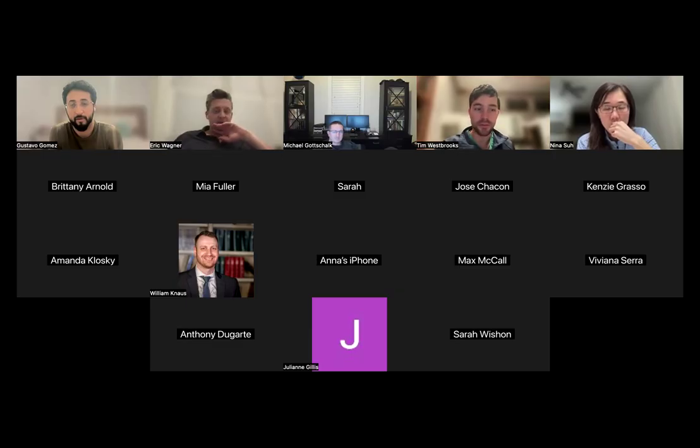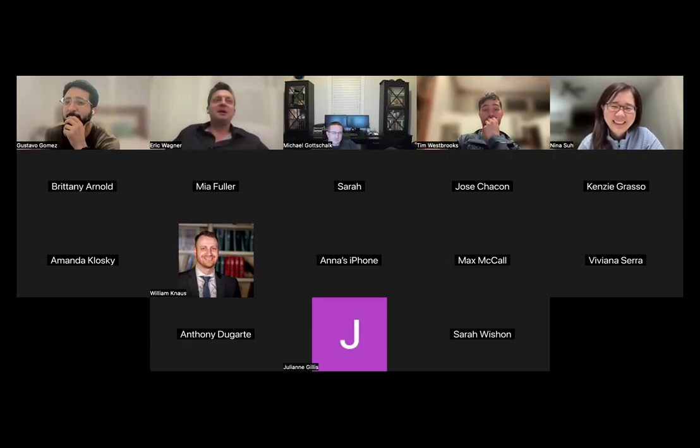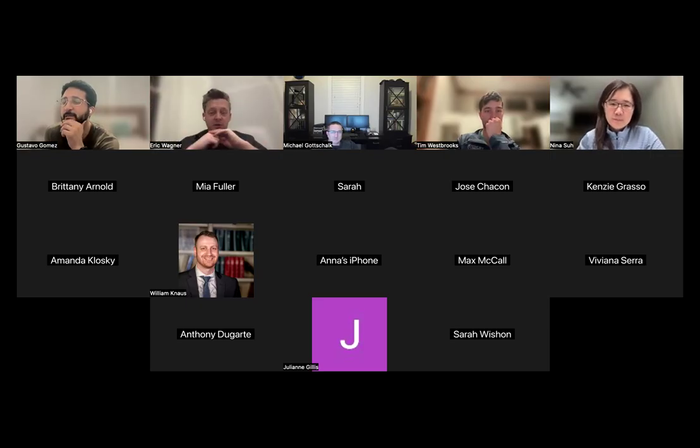That's perfect. Thank you. That's awesome. Thank you, Tim. Gustavo, can I push you a little bit on this? As a disclosure, I do like the dorsal spanning plate. So I want to push you a little bit on the dorsal plate comment, because you said that when you put it in traction, it reduces via some of the external ligaments, it reduces a lot of the fragments. Not all of them, obviously, especially central portions, but it reduces a lot of them.